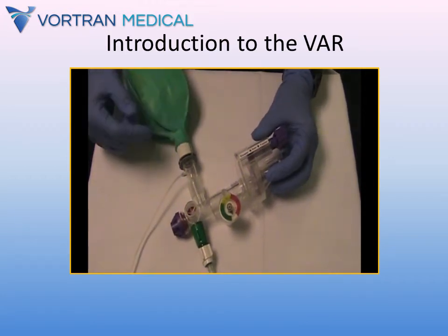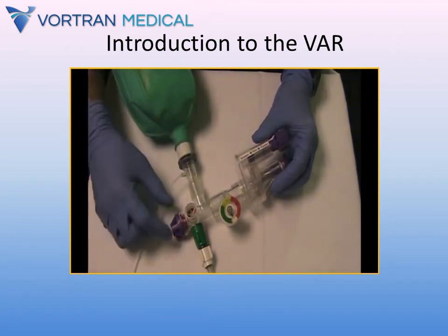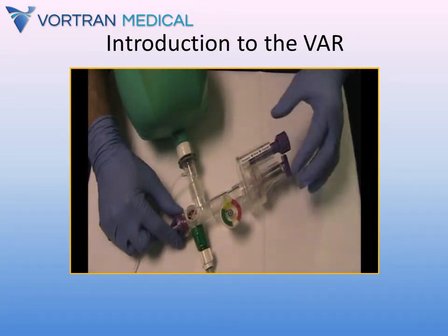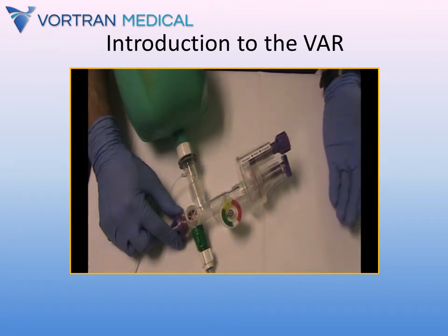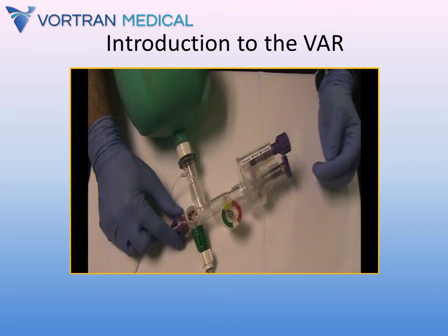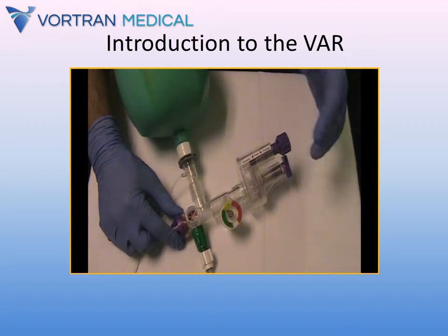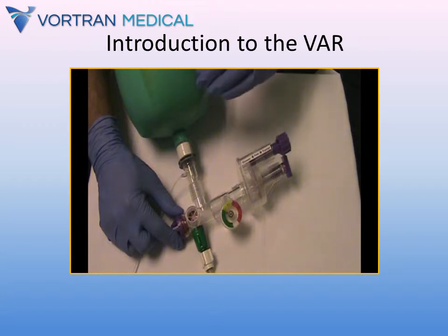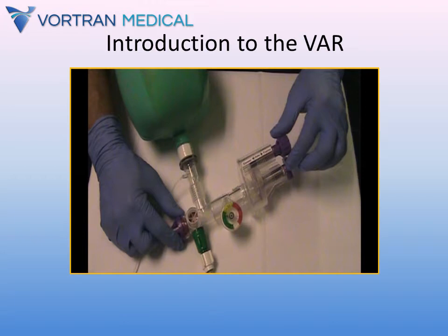Now you can see once the lung inflates, the manometer will start to read a pressure. When it reaches the preset peak inspiratory pressure right here, the valve will open and it'll allow you to exhale. Now this comes right out of the bag set at about 25 centimeters of water pressure for a PIP. And you generally get a respiratory rate of about 20, but that's way too fast for us. So every time we hook the VAR up, and after the VAR starts to cycle, we'll take the round rate knob and screw it all the way in until respiration stops.